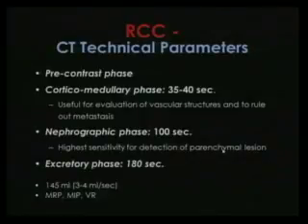If we talk about technical parameters, we need, and this is essential for a full characterization of the lesion, to have a dedicated renal protocol. With that, we need pre-contrast and post-contrast images in arterial, venous, and delayed phases. Pre-contrast images are basically for measurement of the lesion and to see if the lesion enhances after contrast administration. Also for evaluation of calcifications and for evaluation of fat.